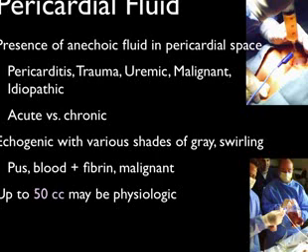In fact, this picture here is one in which we did an ultrasound-guided pericardiocentesis, and you can see this. That's about a liter of fluid that I drained off of a patient because she had uremic pericarditis from renal failure, and basically we were able to take a liter off her heart because it took so long to accumulate that the pericardium was able to stretch over a long period of time. But when you get stabbed, the pericardium can only accumulate up to 200 cc's at the most before you get to pericardial tamponade.